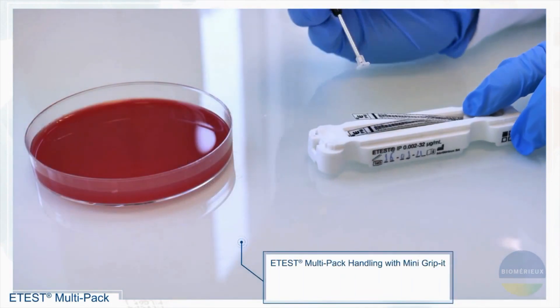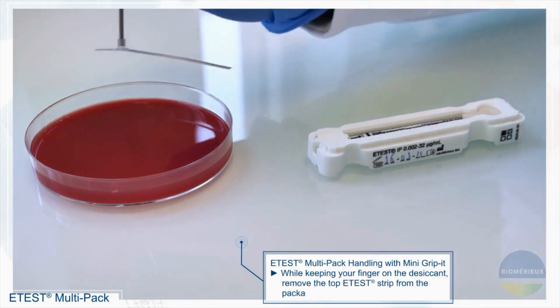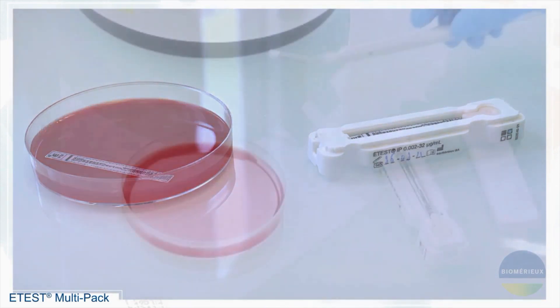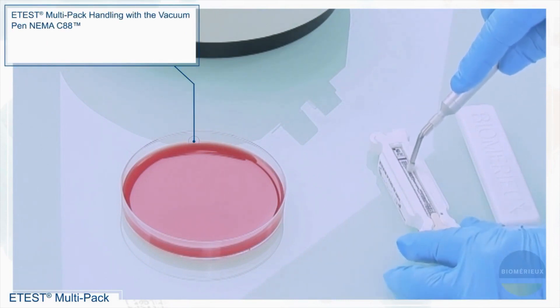eTest handling with MiniGripIt. While keeping your finger on the desiccant, remove the top eTest strip from the packaging using the MiniGripIt. eTest handling with the vacuum pen NEMA C88.